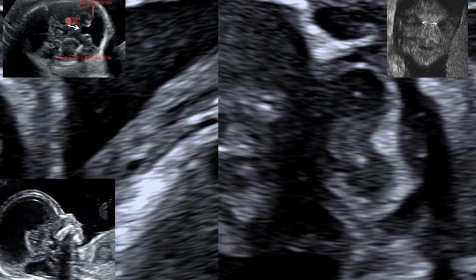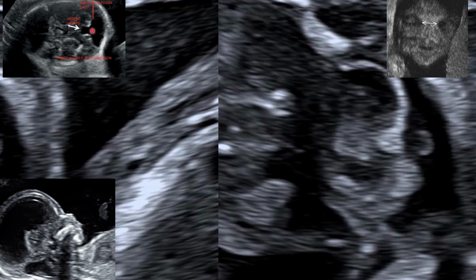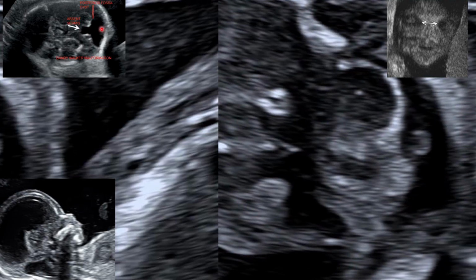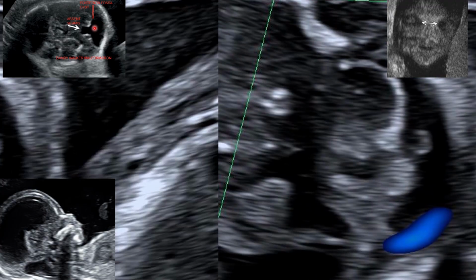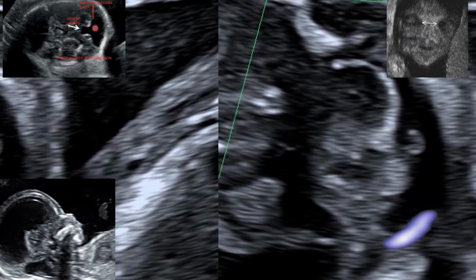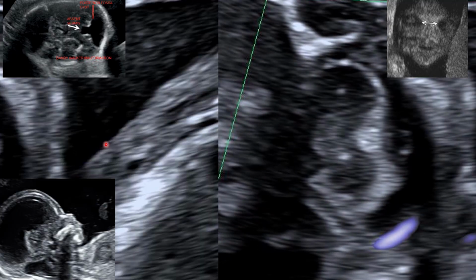Walker malformation. As you see here, you can see this fluid. The distance here is very much exaggerated. There's an increased fluid at the back of the posterior fossa in the cisterna magna, and you can also see that there's no vermis there. If you see this sonographic finding, you must know that you're dealing with a case of Walker malformation.